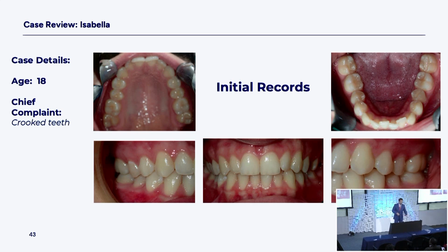So we're looking at a little bit of crowding. You could see 7, 8, 9, 10, there's a little overlap in the top front teeth, and there's a little more crowding in the lower. From 22 to 27, we got a little more crowding. But remember, anterior crowding is a symptom. What do you really have? Improper arch form with an inclination.